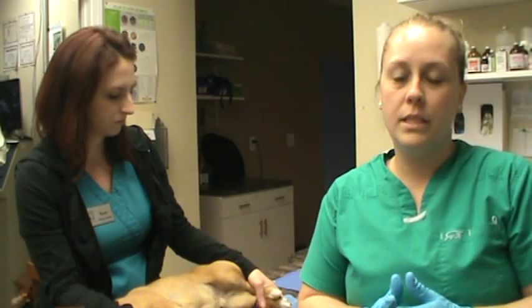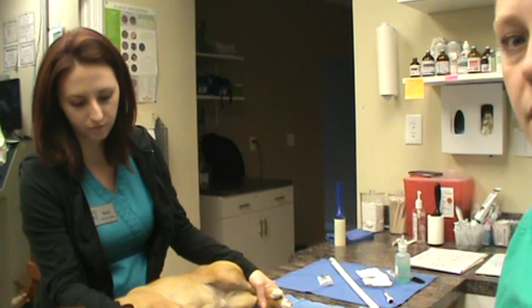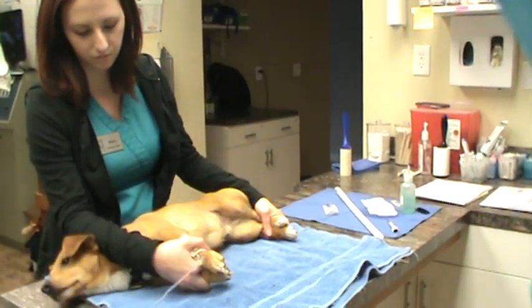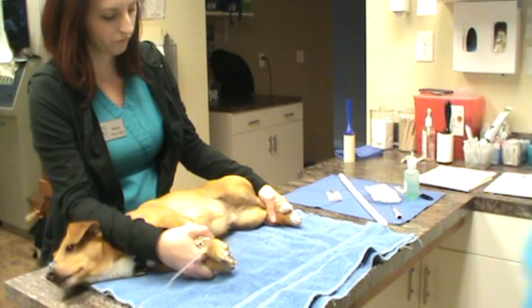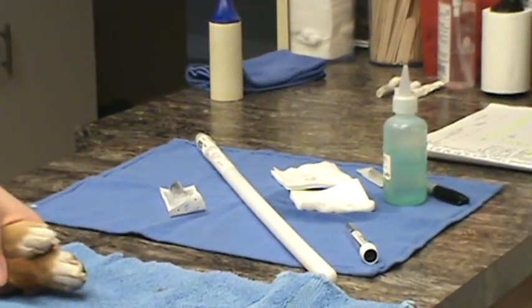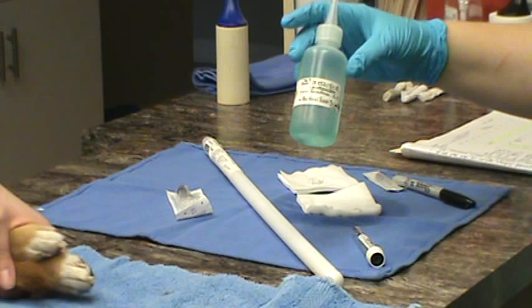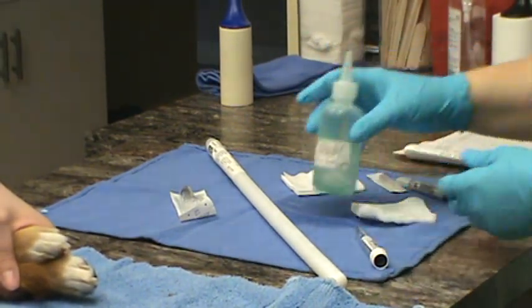This is Chelsea Marks for VETT 220 test 25 and we have our patient Howie here restrained in lateral recumbency. We're going to go ahead and pass a urinary catheter, so we're going to show you our tray of supplies over here, which includes our antiseptic solution — chlorhexidine — that we're going to rinse the penis with.